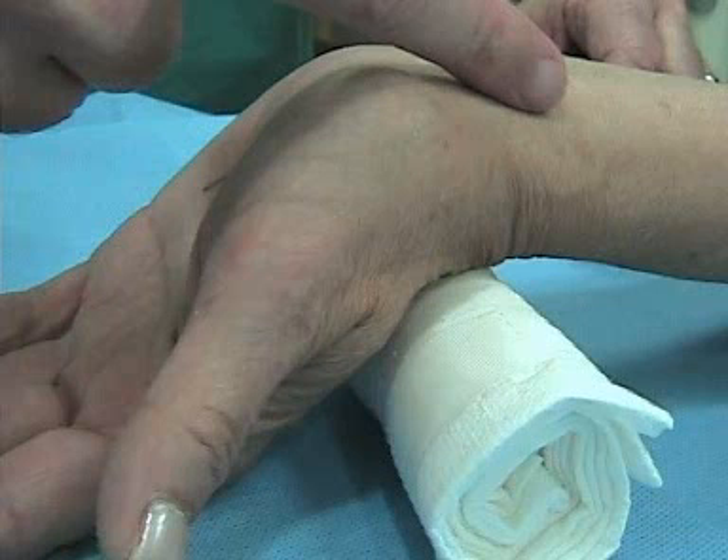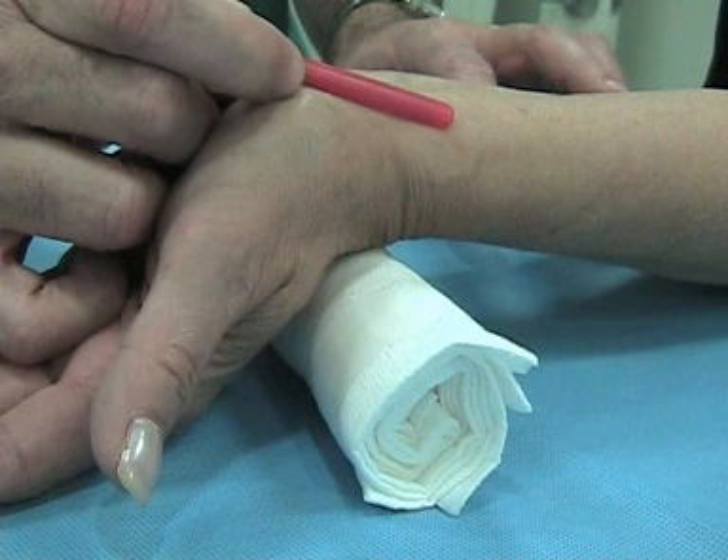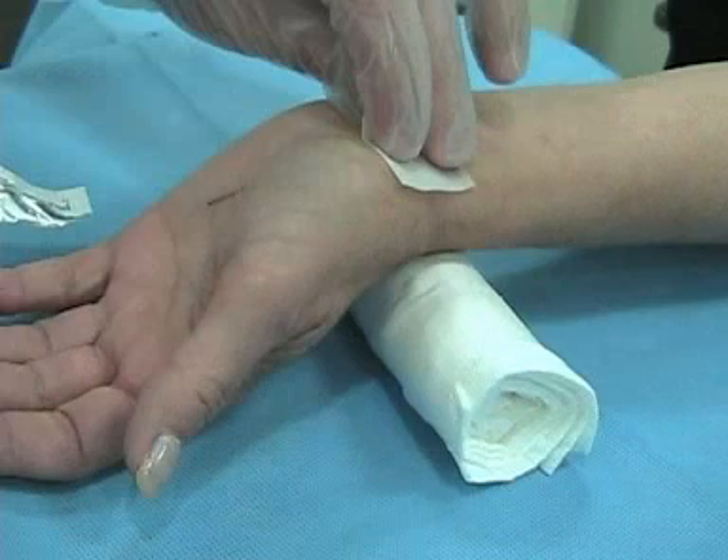You've cranked the wrist back — don't overdo it because you can get a median nerve stretch. By extending the wrist you get a much straighter shot. I'll illustrate that with the red cap of a needle: when the wrist is extended, you get a straight shot into the artery, which makes life a lot easier.